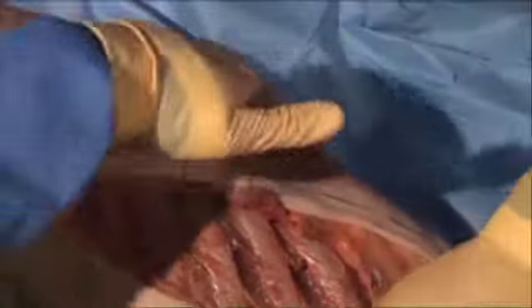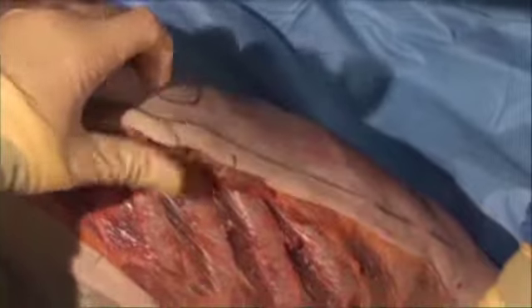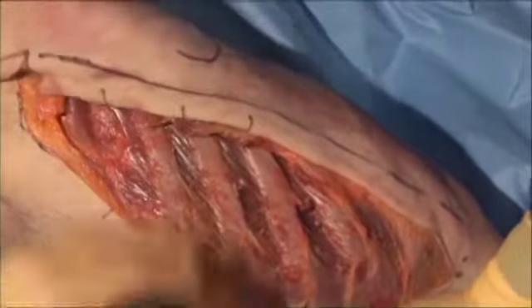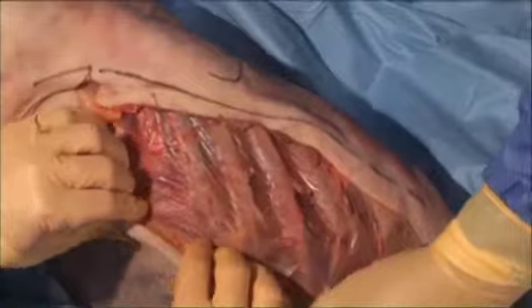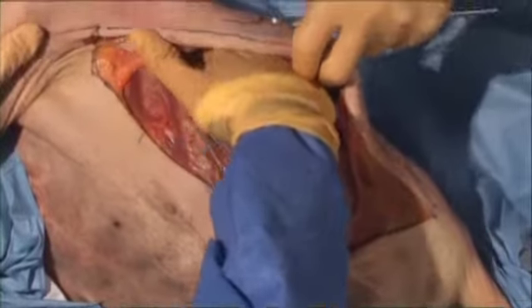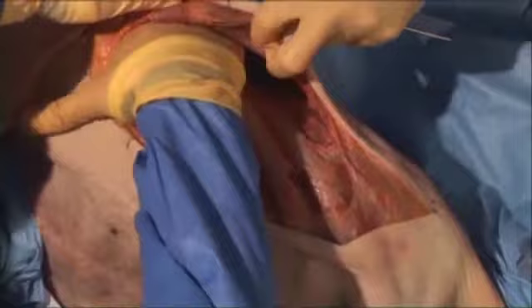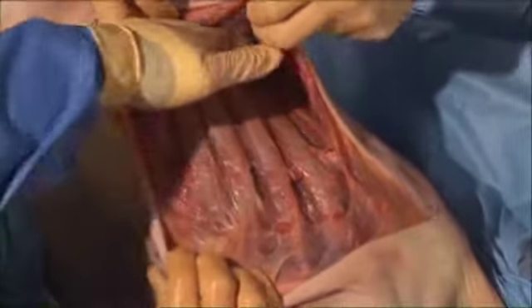In addition, the whole skin is also still connected to the muscle, so the whole flap here has good vascularity, and you don't have to worry about creating a dead area. Now you can also work, so right now I'm touching the transverse processes of all of the ribs in the back. I have total access through there.